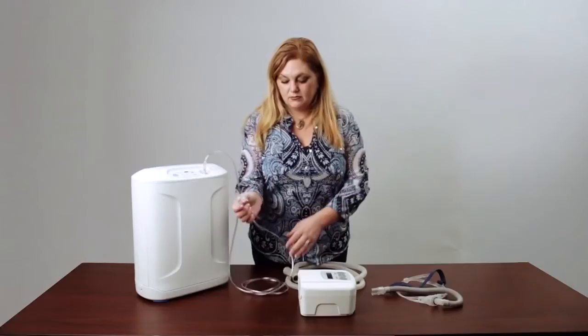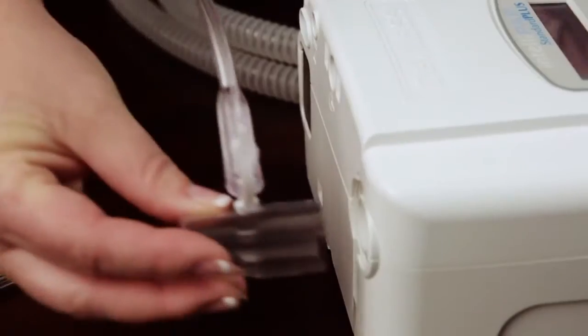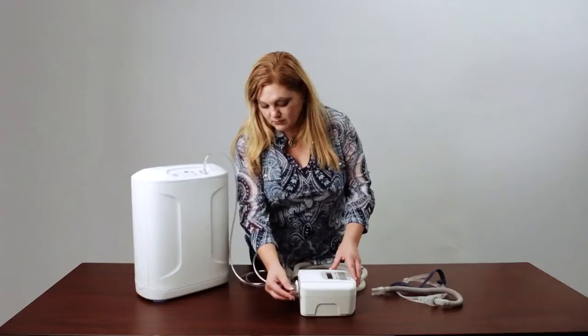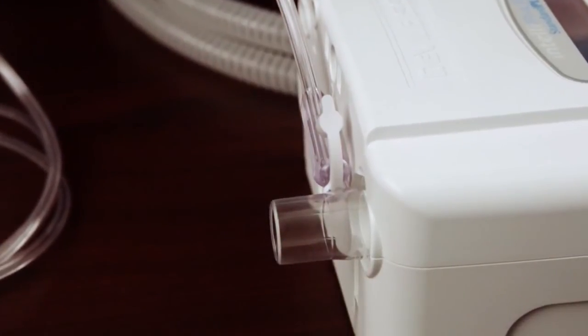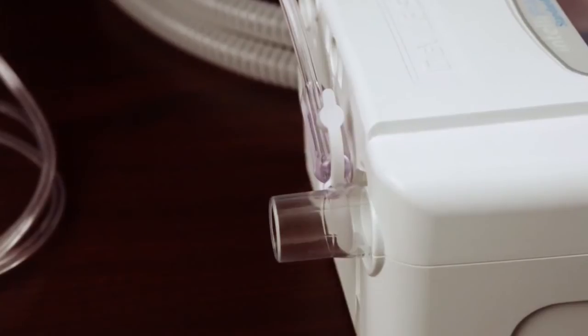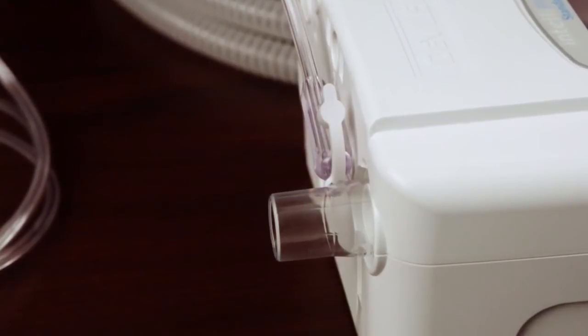Connect the oxygen bleed-in adapter with the oxygen tubing attached to the air pressure outlet on the CPAP machine. The large opening on the adapter will fit directly onto the CPAP machine.